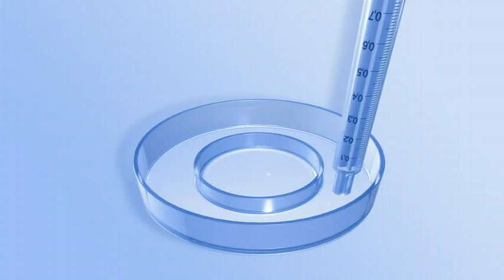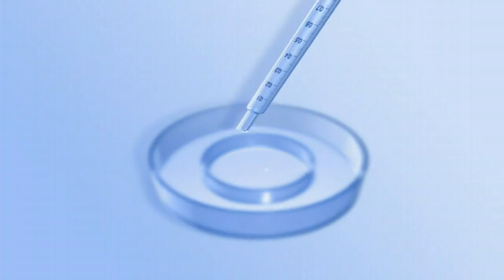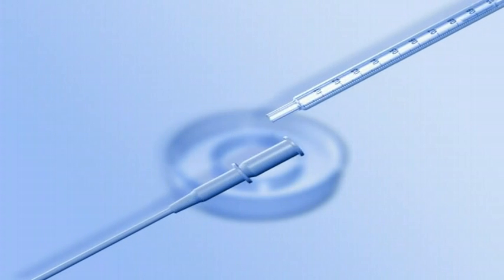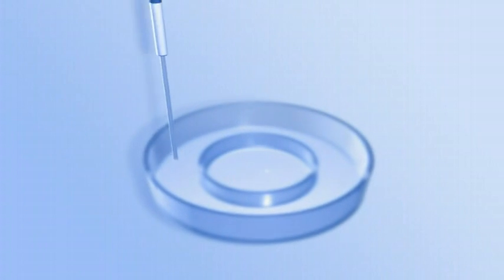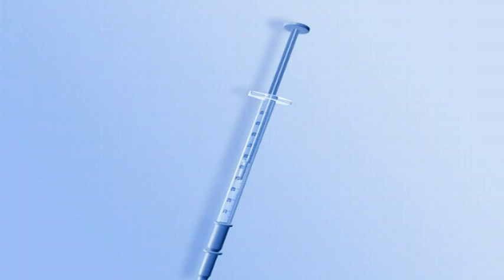Draw approximately one milliliter of embryo glue from the moat with a syringe. Attach the syringe to a transfer catheter. Flush the medium through the catheter.